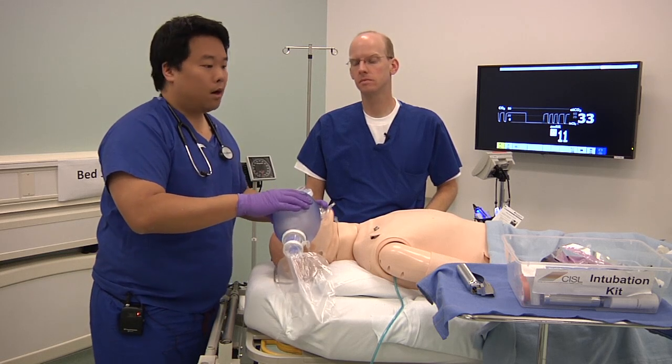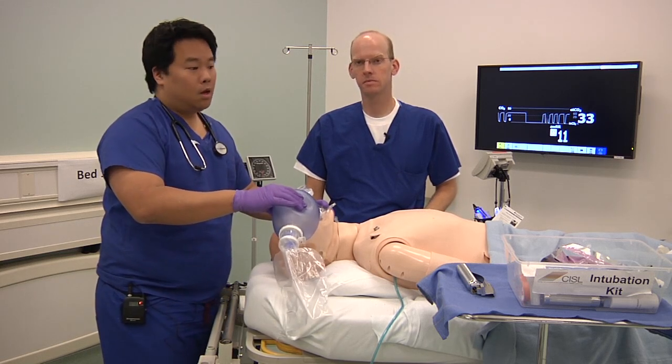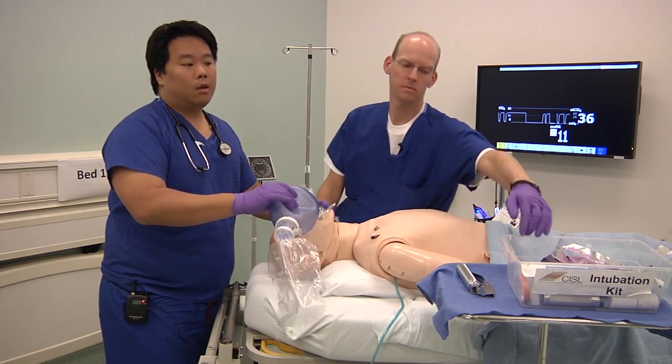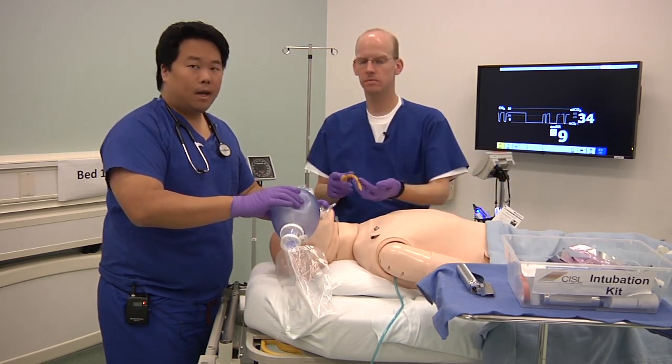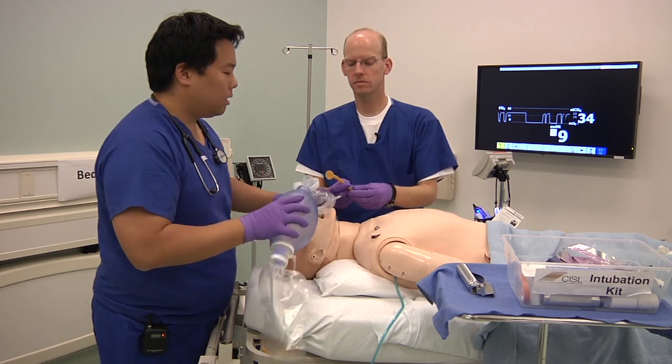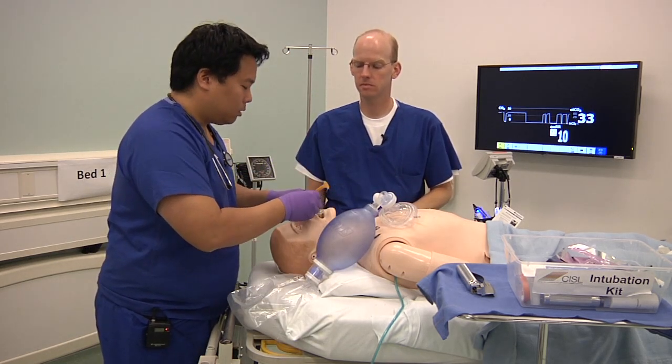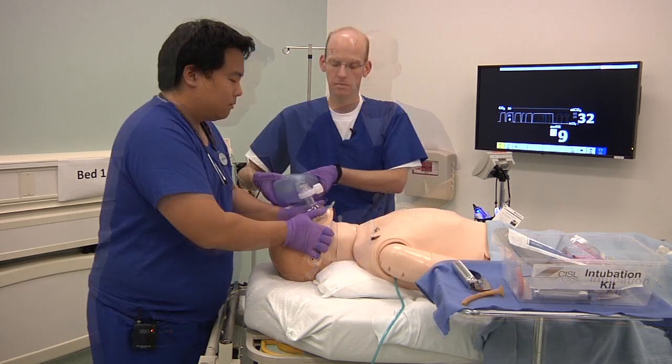Now there are other airways that you can insert as well. You can also insert nasal airways. If you insert an oral airway and you're still not getting good ventilation, you can go ahead and lubricate a nasal airway and insert that into the patient.